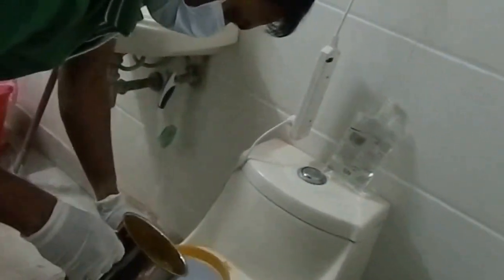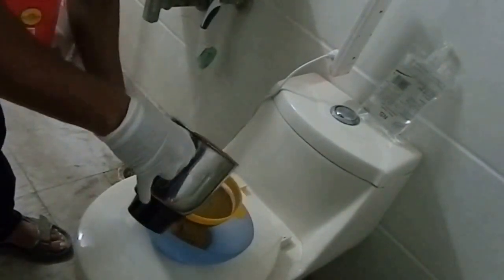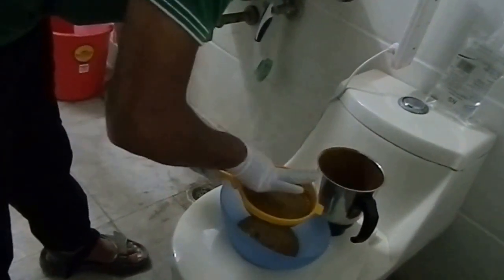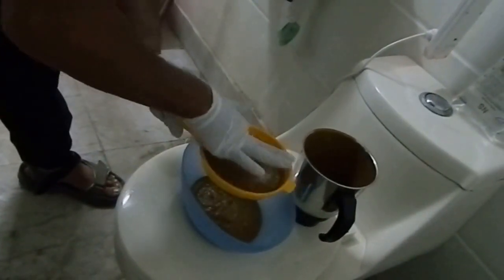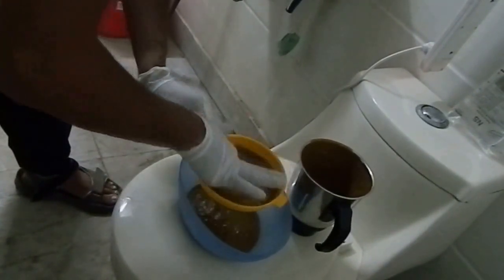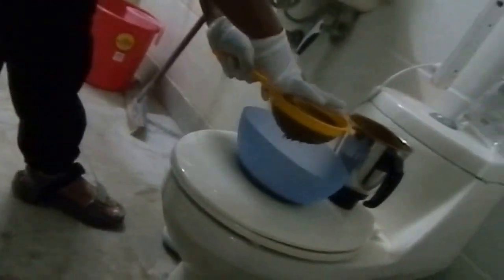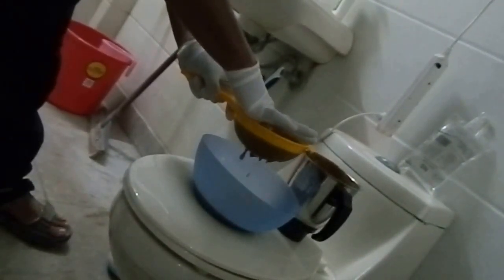Now, you pass it through the strainer. As you will see, not much of it comes out at the first go, so what you want to do is pour it out completely onto the strainer. Then what you do is stir it like that so that poop can actually pass through. You have to remember that you need to prepare approximately 350 ml of strained poop, so you have to be really patient. The spoon wouldn't help because you have to actually touch the strainer, but since you are wearing gloves it shouldn't matter all that much.